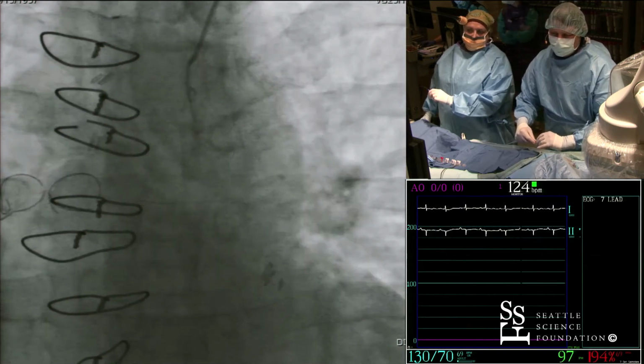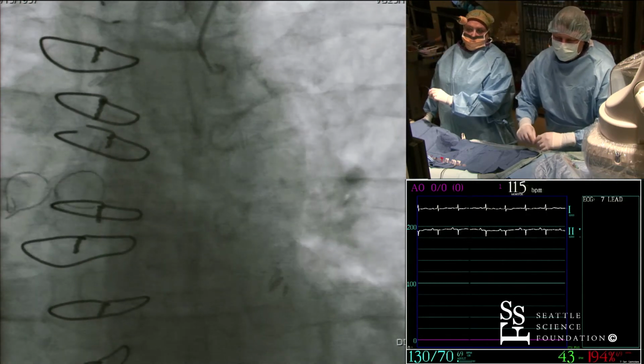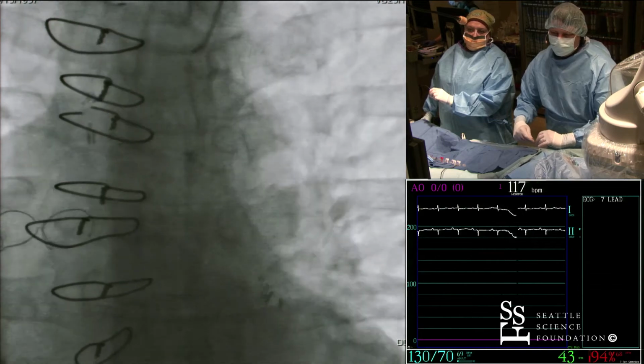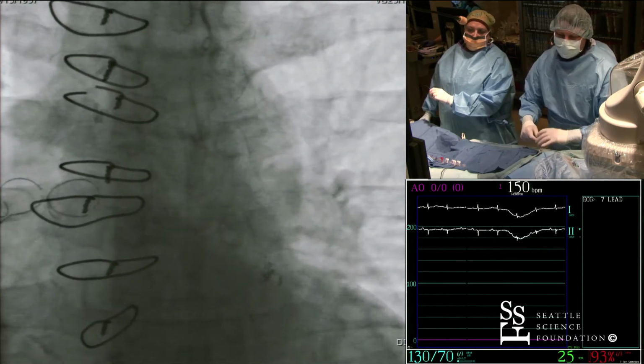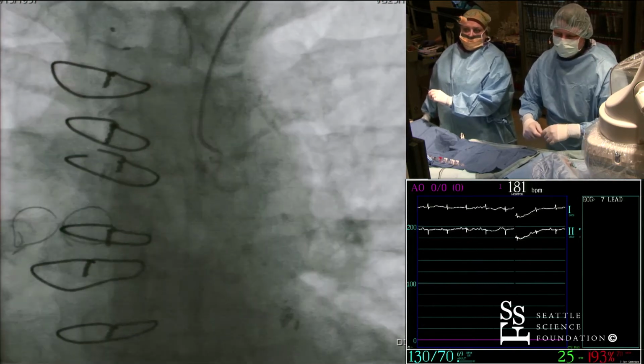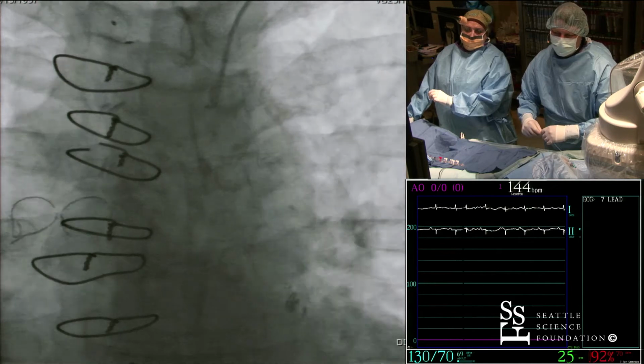Now, one of the issues... Sometimes you can have the patient take a deep breath. Yeah, that's what I'm going to do next, lower the diaphragm. Mr. D, would you take a deep breath in there for me? So going up on the left side, yeah, go ahead and breathe. It's nearly always easy just to rotate that over and go down. The Rosen wire is a little bit stiff, so sometimes it's a bit of an issue.